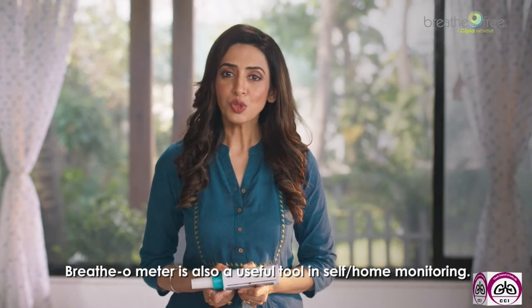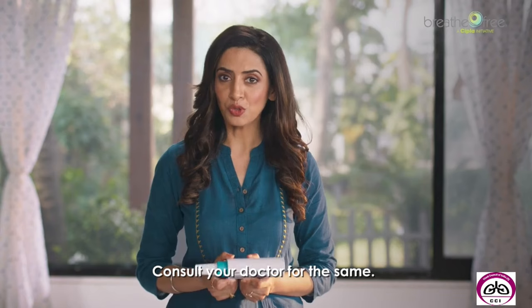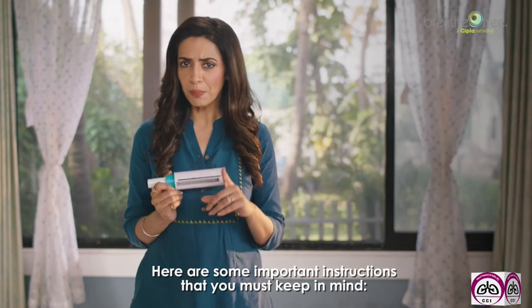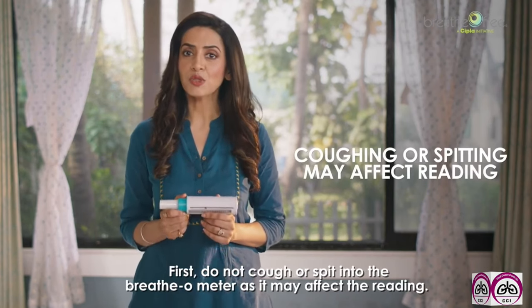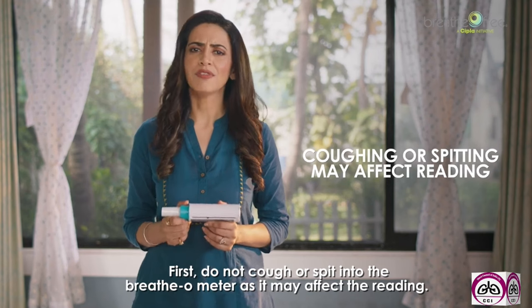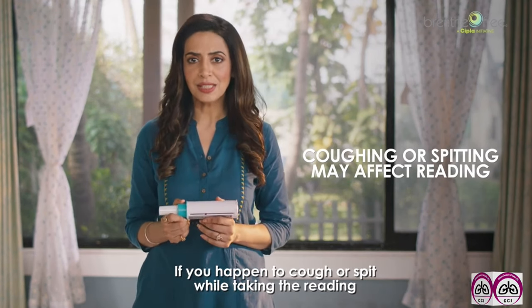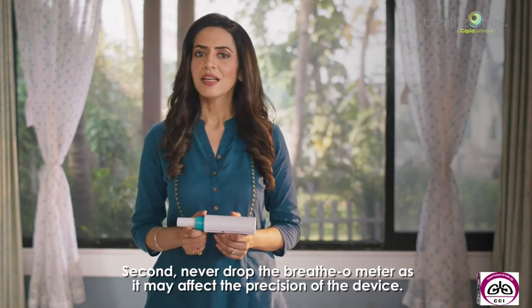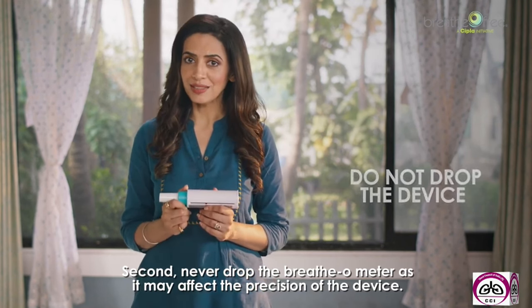Breathometer is also a useful tool in self or home monitoring. Consult your doctor to know more about home monitoring. Here are some important instructions that you must keep in mind. First, do not cough or spit into the breathometer, as it may affect the reading. If you happen to cough or spit while taking the reading, it is recommended to take a new reading. Second, never drop the breathometer, as it may affect the precision of the device.